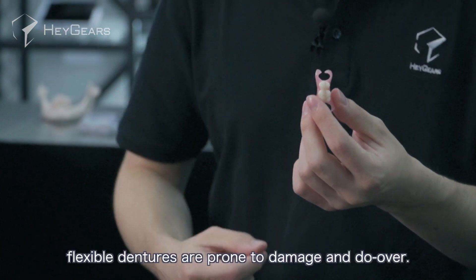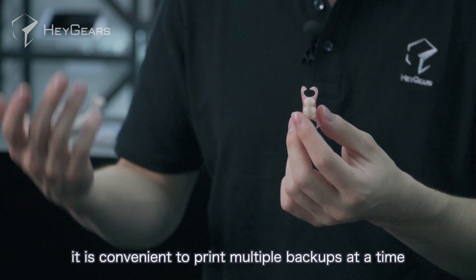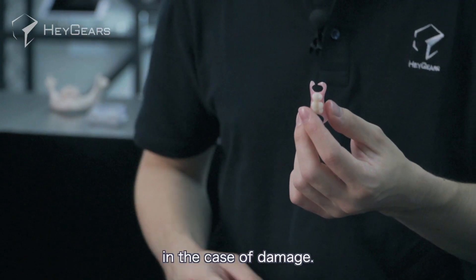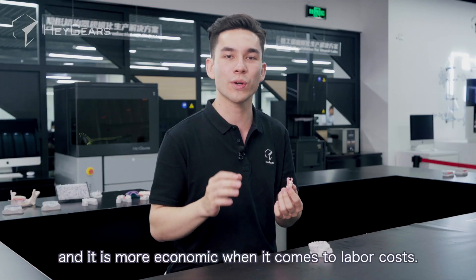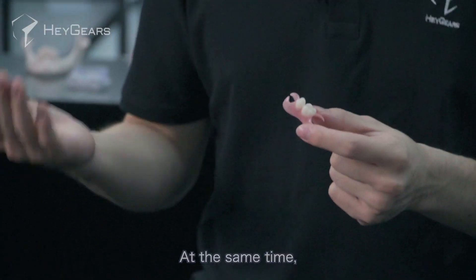As a transitional product, flexible dentures are prone to damage and do-overs. Therefore, with the help of a digital approach, it is convenient to print multiple backups at a time, or print directly from recorded data in the case of damage. Digital manufacturing greatly simplifies the production process for dental technicians and is more economical when it comes to labor costs.